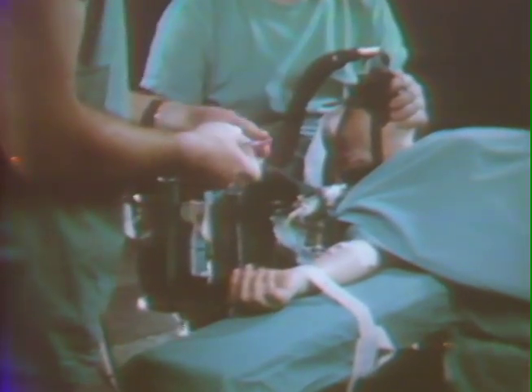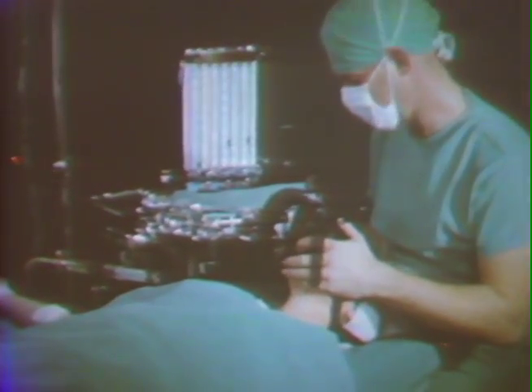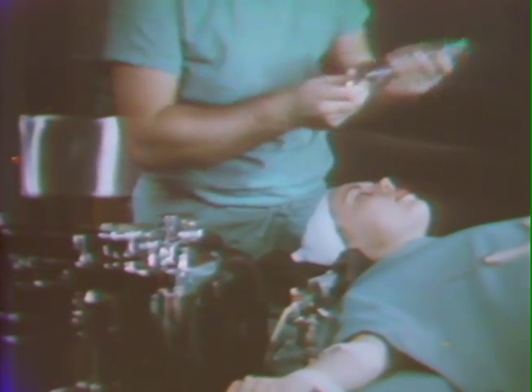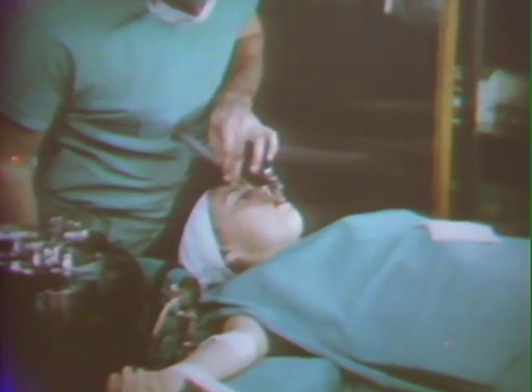In order to provide profound relaxation of the mandible and facilitate endotracheal intubation, a short-acting muscle relaxant is given intravenously. The anesthesiologist ventilates the lungs manually by squeezing the breathing bag before performing laryngoscopy and inserting the endotracheal tube. The endotracheal cuff is inflated to provide an airtight fit between tube and trachea, and the tube is securely taped in place.